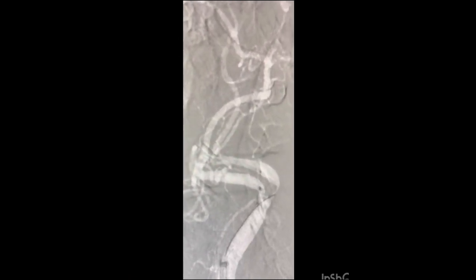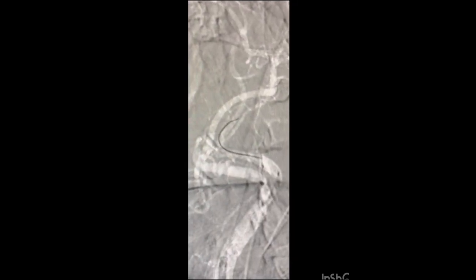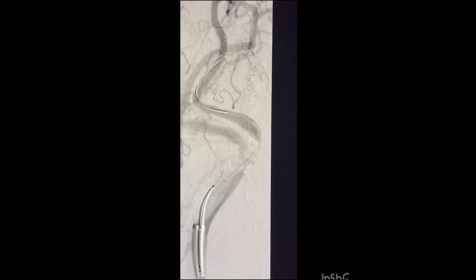to cross the stenosis with a Traxus wire and do an initial 2 mm balloon angioplasty. This initial angioplasty was performed to allow smooth navigation of the filter. Thereafter, the wire of the Embo Shield was taken across the stenosis, parallel to the Traxus wire.